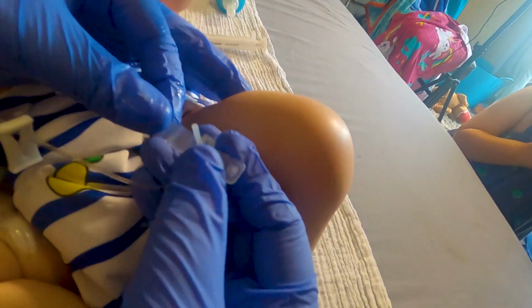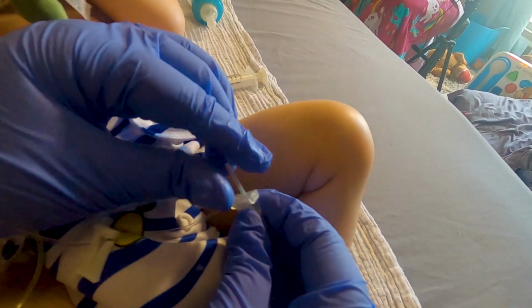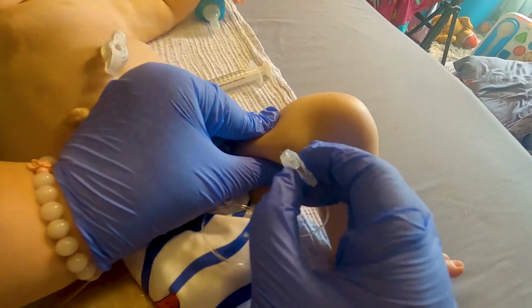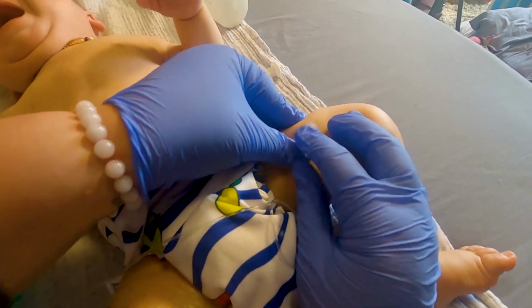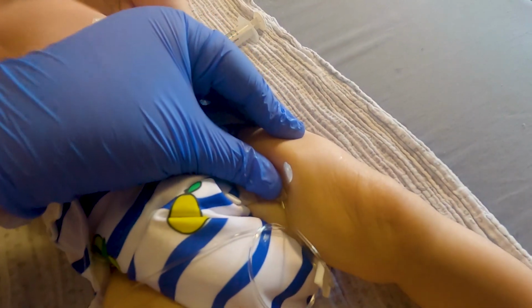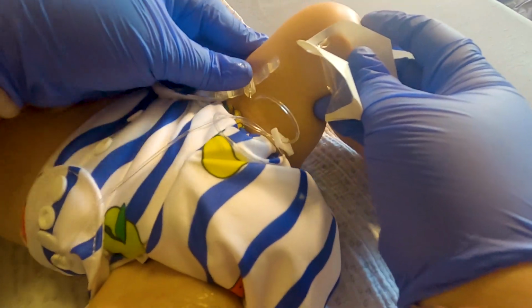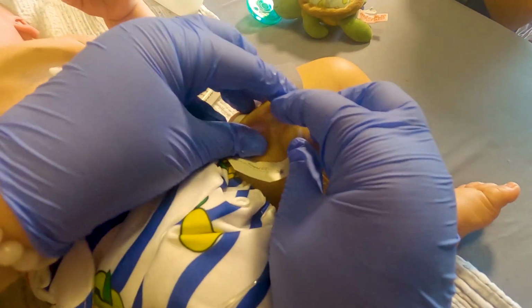So it has a little cap on it. So I take the wings back. Make sure it's nice and dry. Pinch and stick. Oh, bye-byes. Oh my gosh. Gabriel? Sister, can you get me another Tegaderm, please?